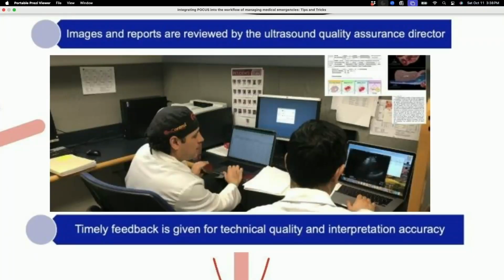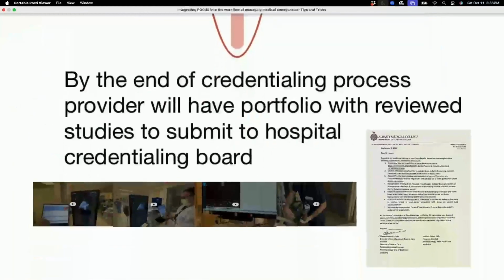The ones that we don't want to bill for or use, we keep in a separate hard drive or cloud where we use them to count how many scans each resident has done, and we can always review them. We have all the scans done from 2015 till now saved.